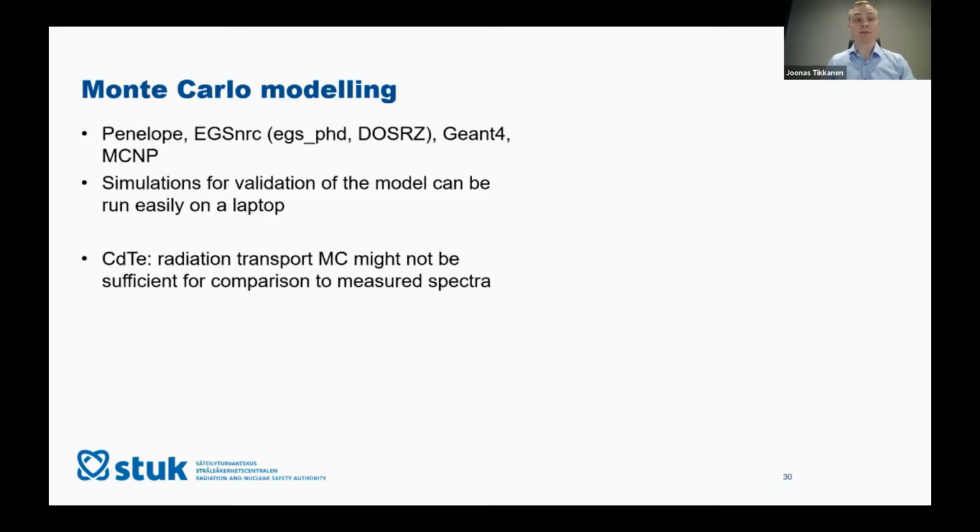And just a note about cadmium telluride, simple Monte Carlo of radiation transport might not be sufficient due to some charge collection issues inside the detector material, but I won't go too deep into this. This is just something you should keep in mind if you want to use a cadmium telluride detector.